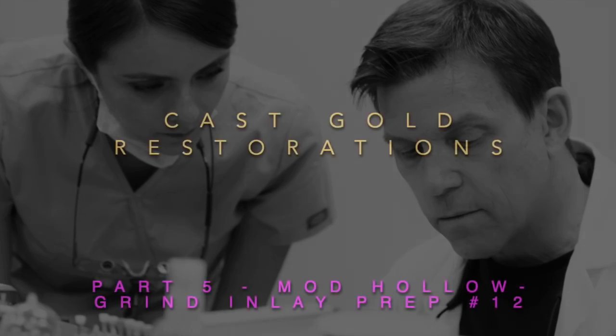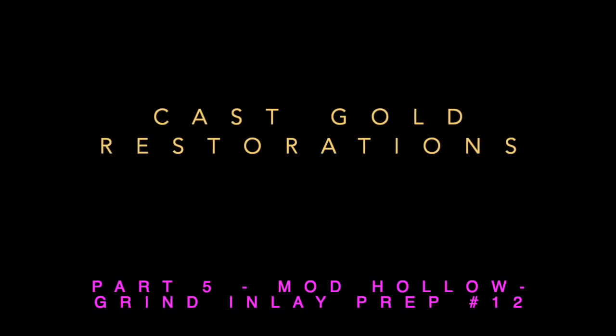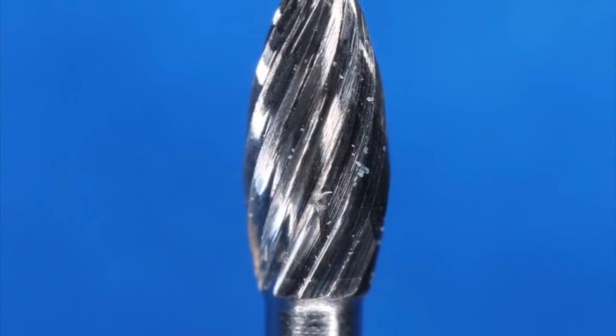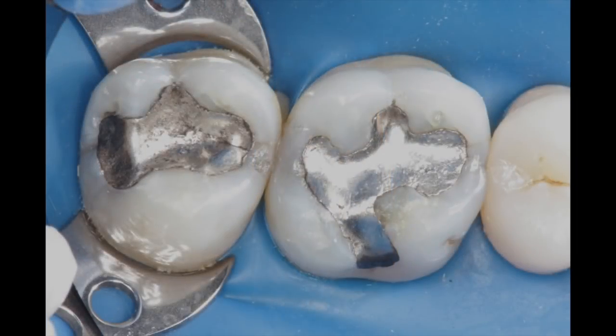Today we're going to discuss part five, which is the hollow grind inlay. You may be wondering, what is a hollow grind? Well, it's essentially any concavity that you can create in preparation utilizing a burr like this, like this 7404. Let me show you some examples.